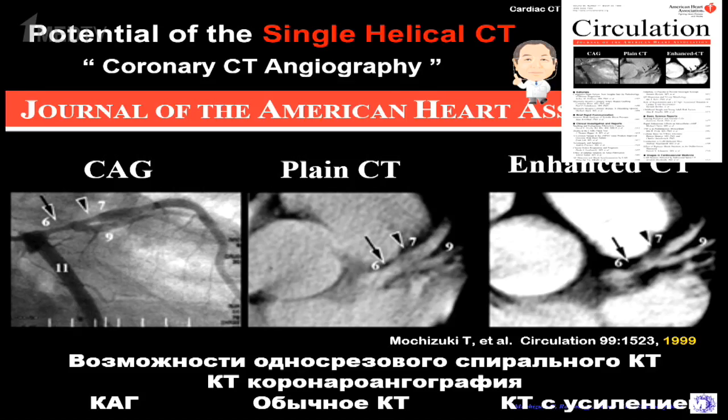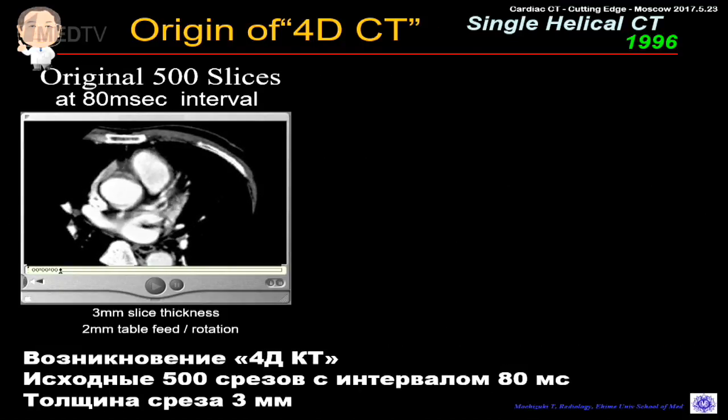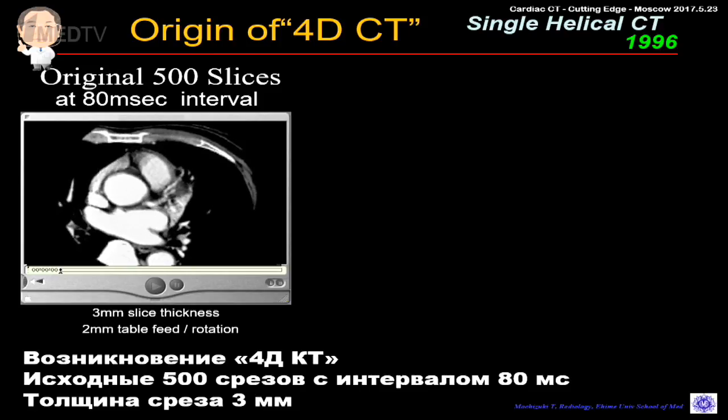So I sent our image to Circulation in 1999, and had presented the potential of the single helical CT for the coronary CT angiography. And we got the cover of Circulation. So this is the image of the single helical CT.